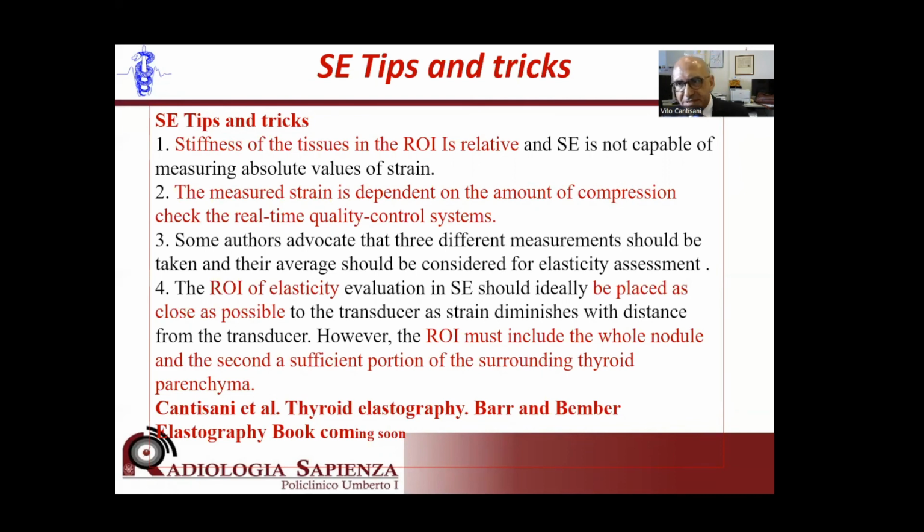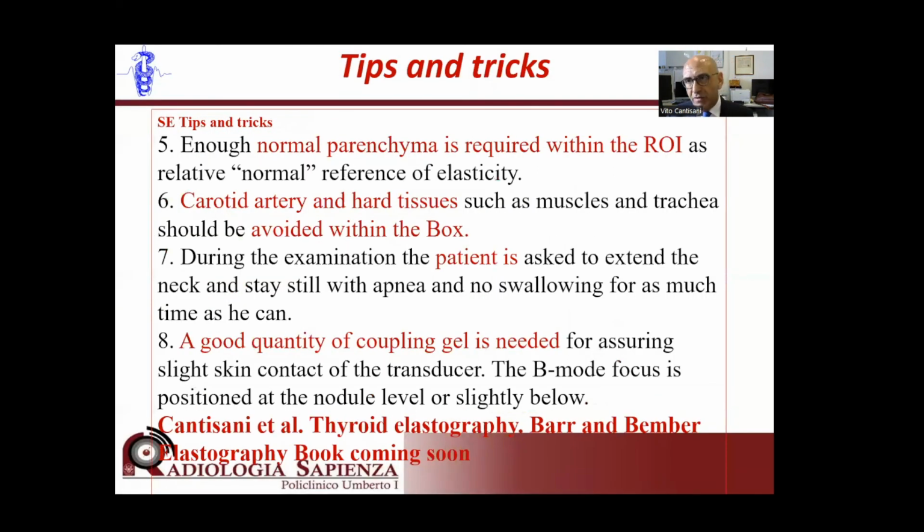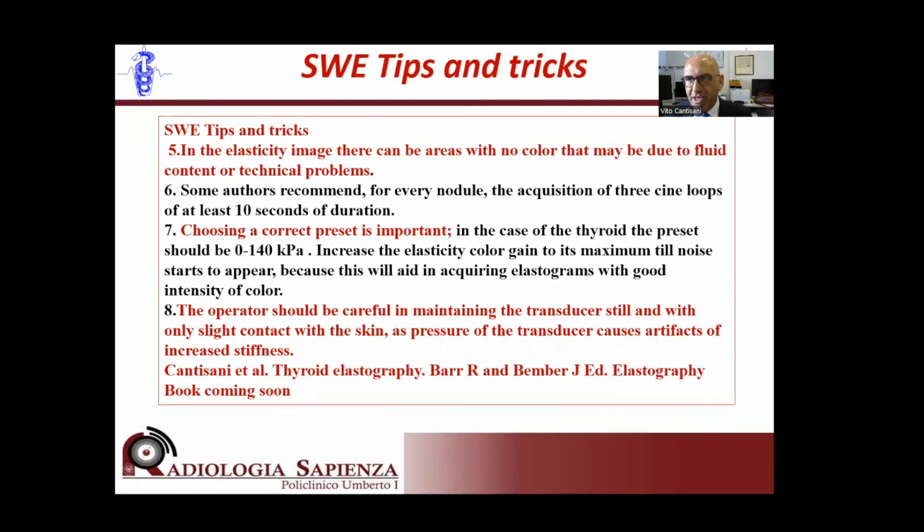Try to be consistent with your examination, and you have to be aware that the ROI should be maintained within the lesion during the whole examination. Then you have to use the right amount of gel, and ask the patient to maintain very, very superficial breathing. With shear wave, similar indications, similar recommendations to obtain a reliable examination.